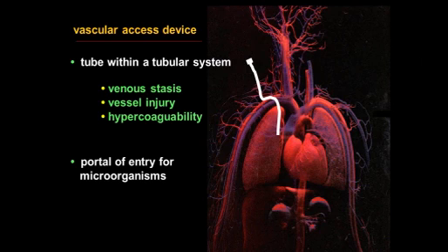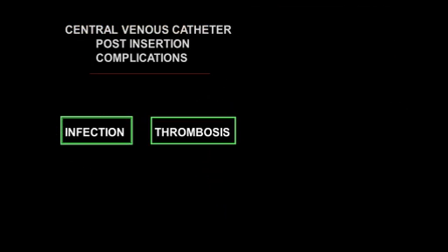And in addition to that, we have one other problem. We also create a portal of entry for microorganisms. So that leaves us, while we are using vascular access devices for life-saving and supporting intravenous therapy, it is still a rose with potentially many thorns.